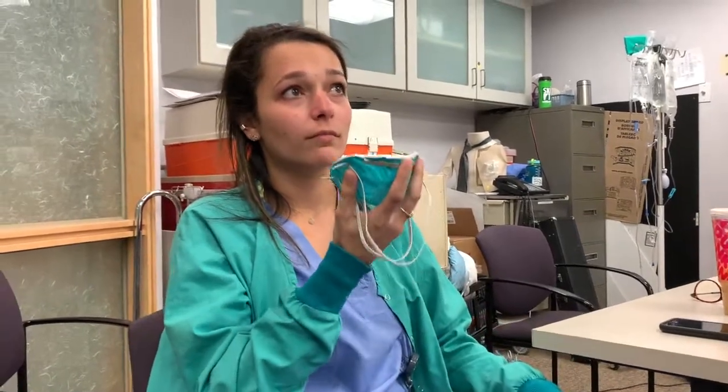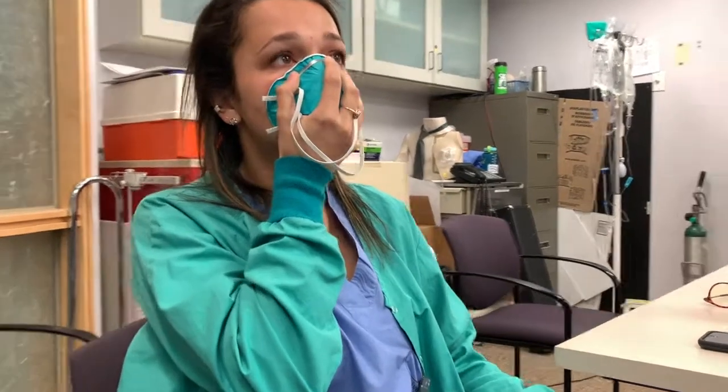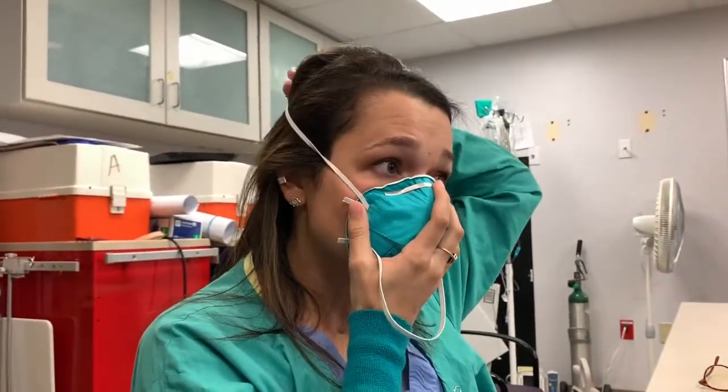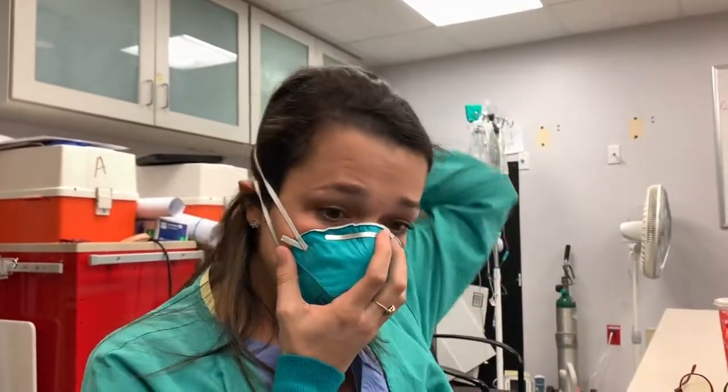Hold your mask in one hand, place it over the bridge of your nose, and make sure it's cupping your chin. Take your first strap and put it over your head — keep it up high. Your second strap goes up and over, down by your neck. Your hair needs to be on the outside of that strap.